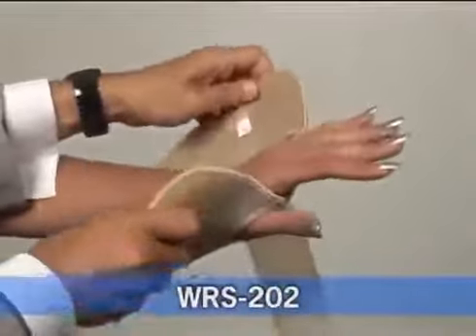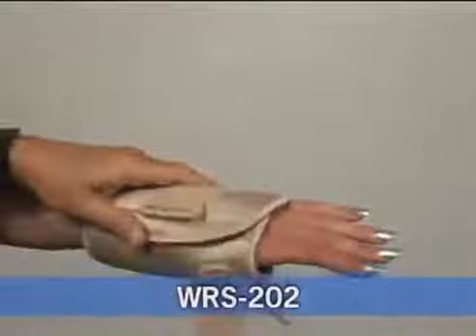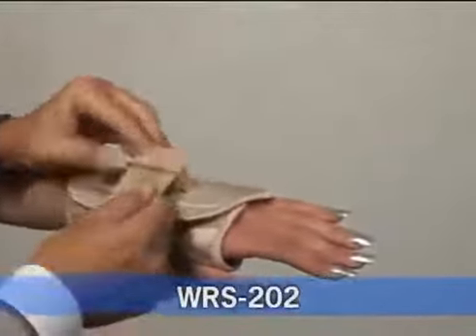This is a very unique wrist splint because it's universal for the right or left hand. It's highly recommended for individuals suffering from carpal tunnel syndrome.